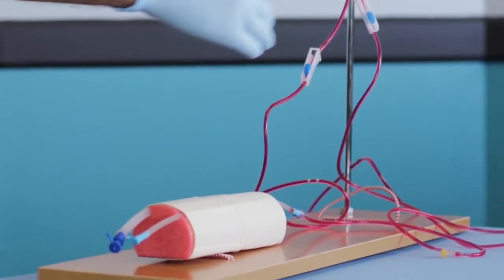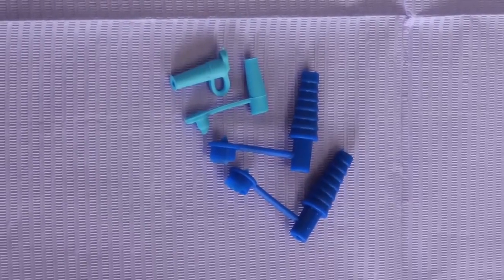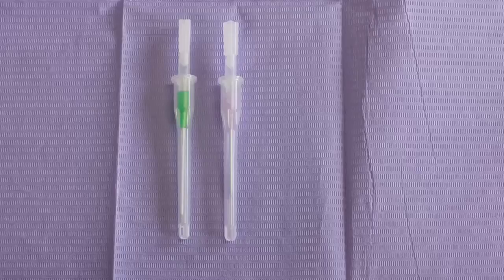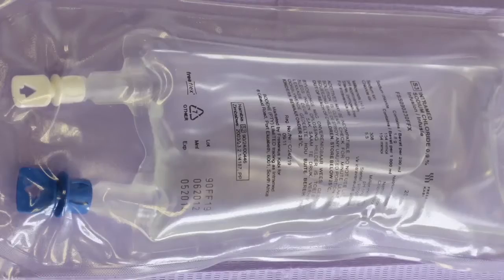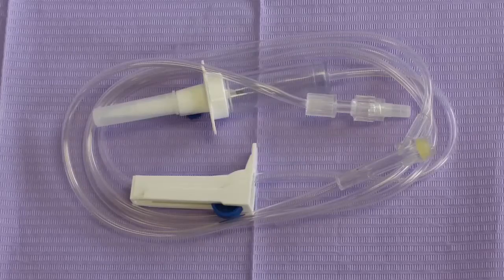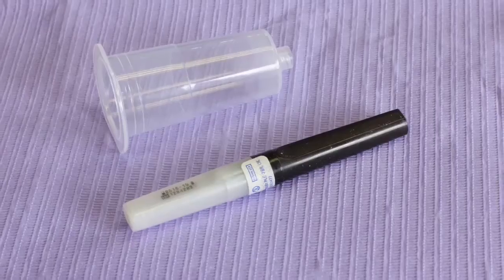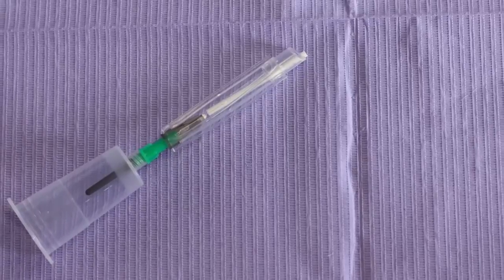Other medical items included are: lumen stoppers and connectors, assorted syringes and hypodermic needles, safety needles, IV catheters, butterfly needles, IV fluid bag, IV lines, a glass vial and a plastic vial, vacutainer hub, needles and tubes, vacutainer hub with safety needle.